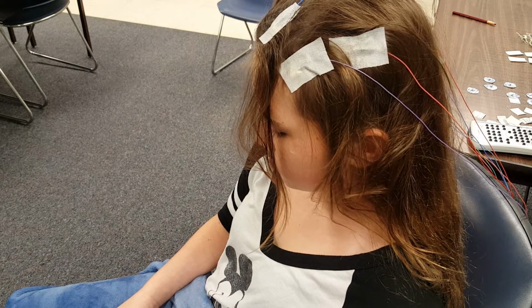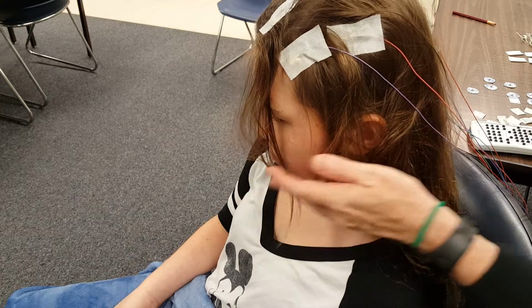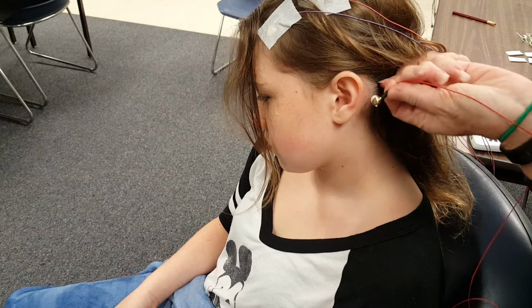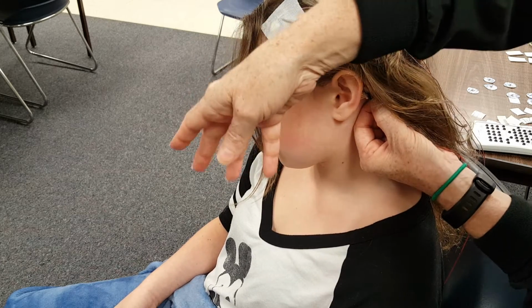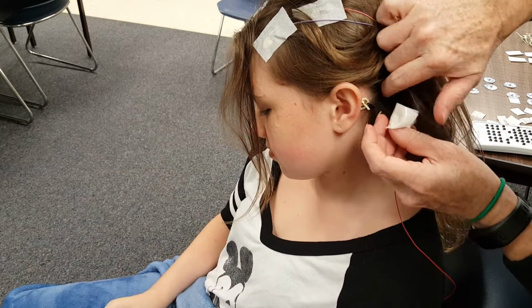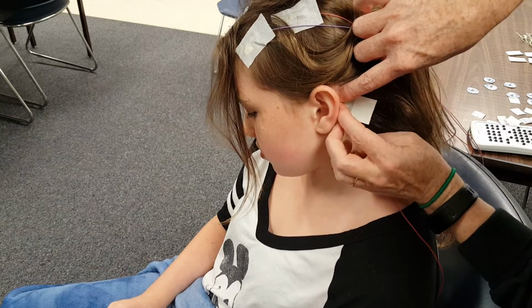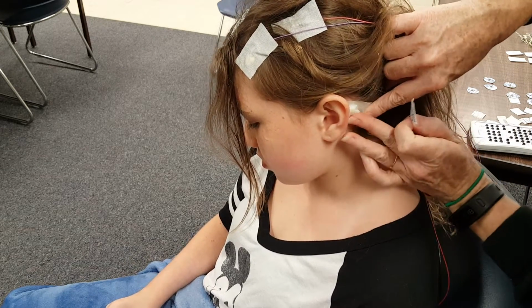Next we're going to hook up or apply electrode to the A1 site, which is our reference, left-sided reference electrode. So you find where you've prepped. Can you tilt your head a little? And then here, again, rather than placing my electrode like this or like this, I angle it down a little bit, like so. Oh, sorry. It's okay. And then go over top with my gauze or my cover roll. It takes some manual dexterity and stick that down firmly. Like so.